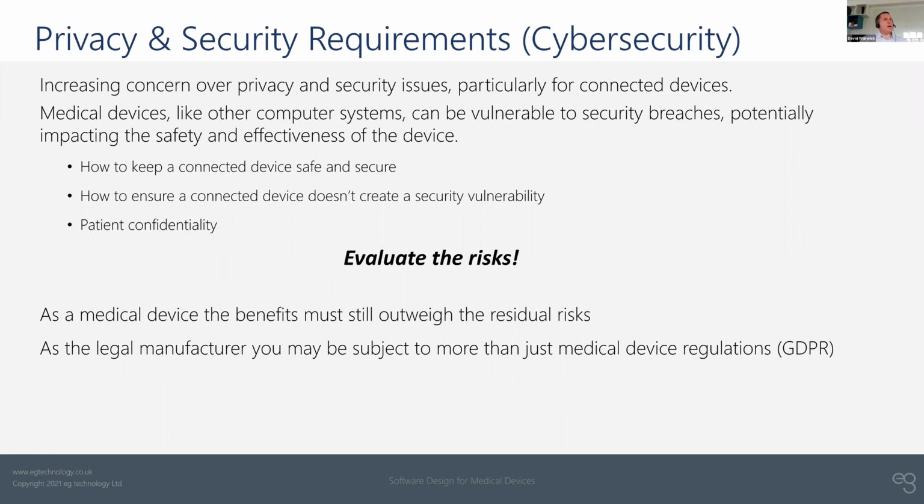At the same time, and in the same way that I talked about not wanting to over-egg the risks of the devices, it's important to not go too far with this, because at the early stage of the product, you need to be able to get your product out there onto the market. You need to evaluate the risks of breaches. But if you're using industry standard things, if you're using a secure connection to something like Amazon Web Services to gather the data, you need to bear in mind that that level of security, that level of data protection, is regarded as state of the art.